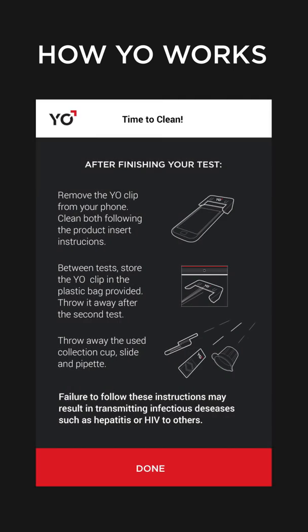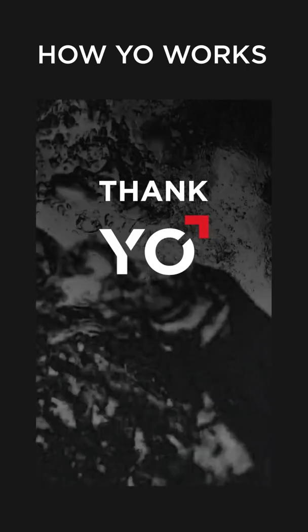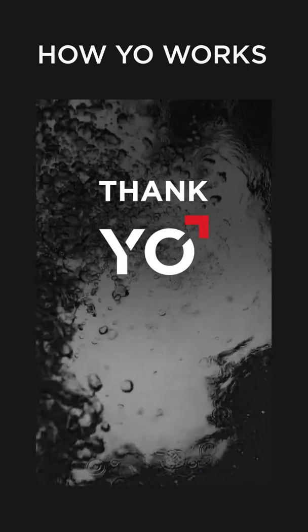It's time to clean. Before exiting YO, it's important to clean your phone and YO clip. Your YO test results are permanently and securely stored in My Test Results. Thank you for using the YO Home Sperm Test.